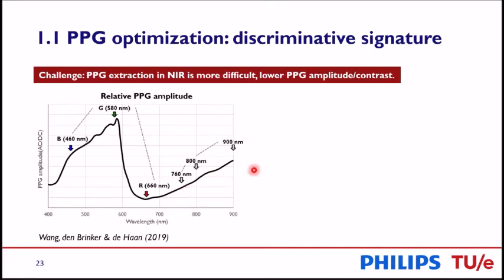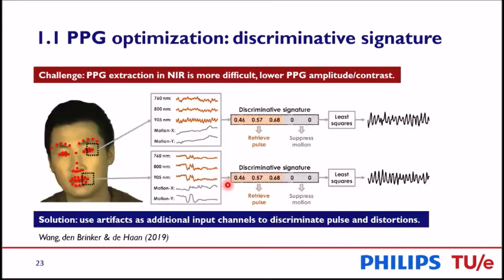So it's much more difficult to differentiate from the motion distortions. And here what we propose is to use the pulse extraction combined with the motion traces. For example, if I use facial landmark tracking, I can get three-dimensional color signals and 2 additional motion signals.